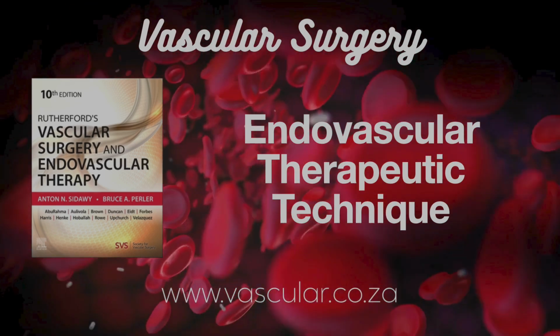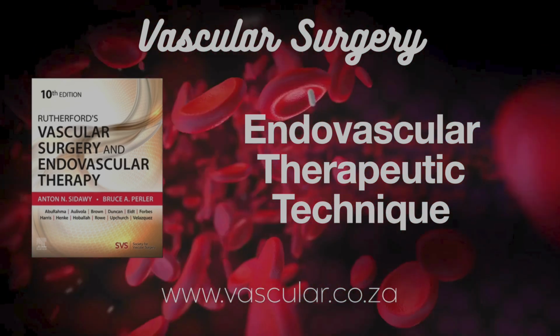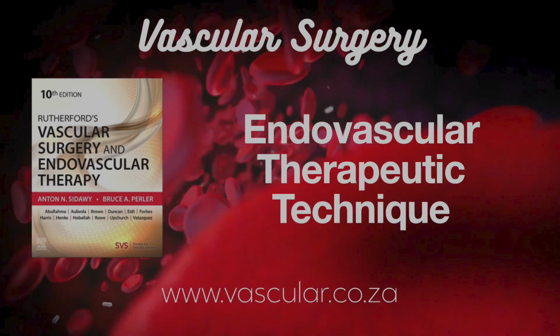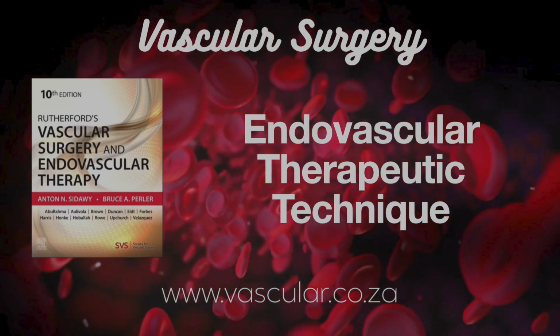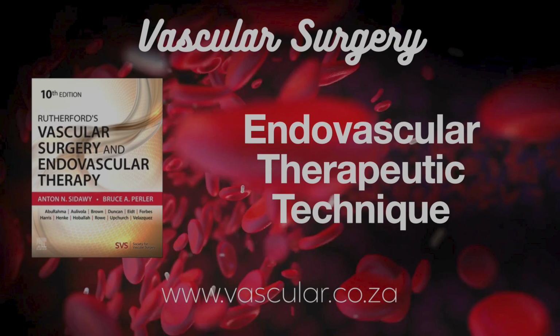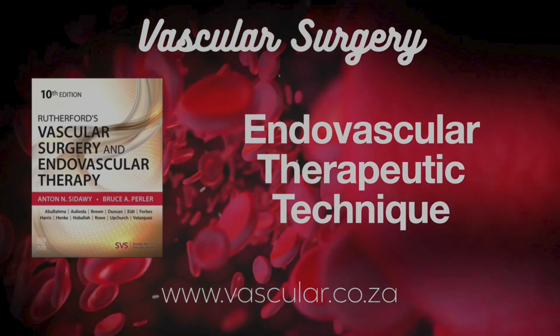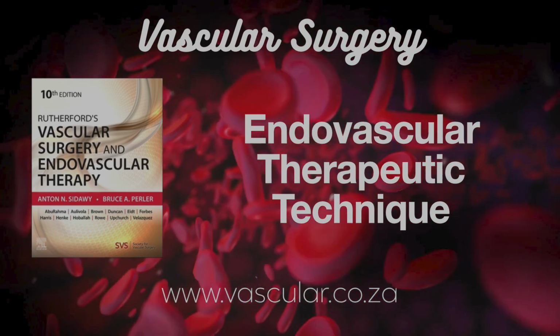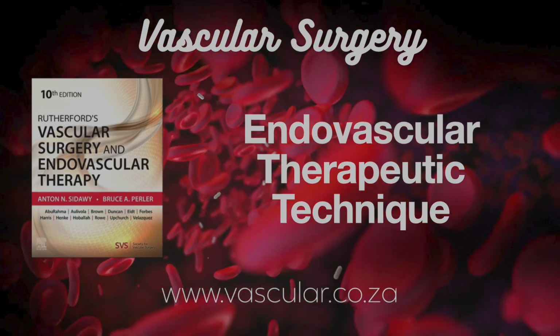How do they work again? They have a self-expanding stent-like mesh. You deploy it across the clot, the clot gets tangled in the mesh, then you pull the whole thing back into a guiding catheter and remove it. The Indigo system from Penumbra is another aspiration system used for peripheral clots, including visceral and upper extremity arteries. It shows how technologies cross over between vascular beds.